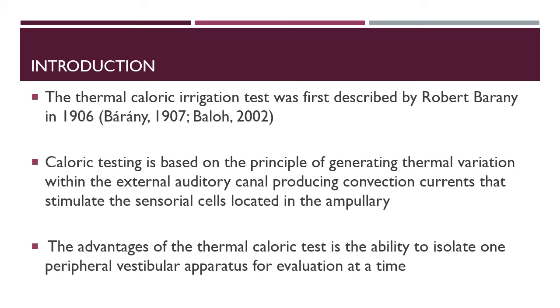So, caloric testing is based on the principle of generating thermal variation within the external auditory canal, producing convection currents that then stimulate the sensorial cells located in the ampulla. The advantage of the thermal caloric test is the ability to isolate one peripheral vestibular apparatus for evaluation at one time.